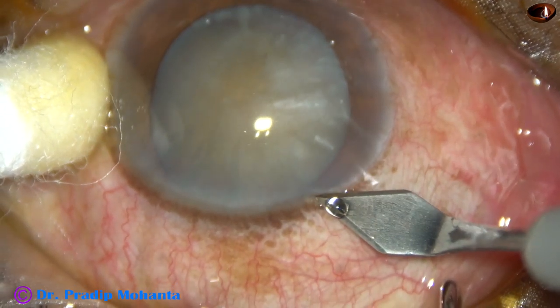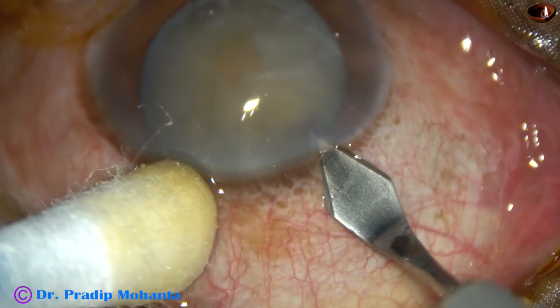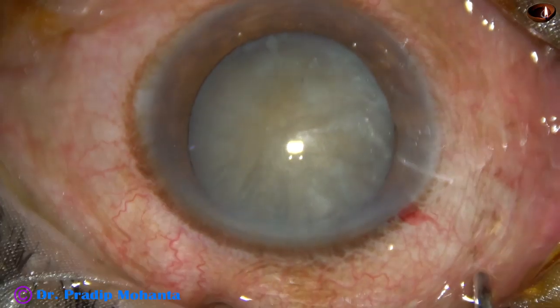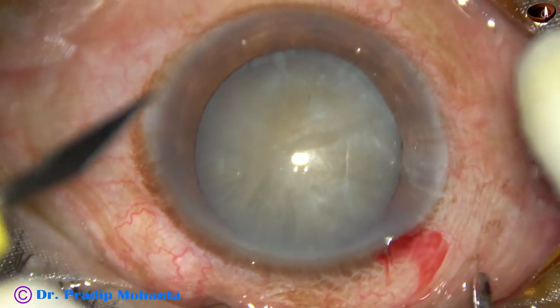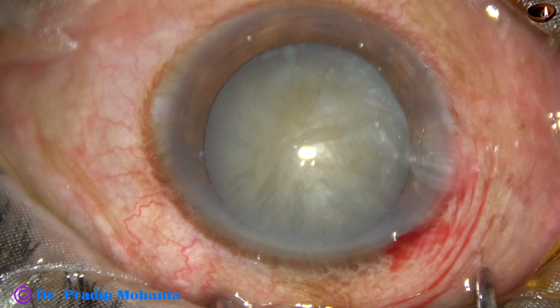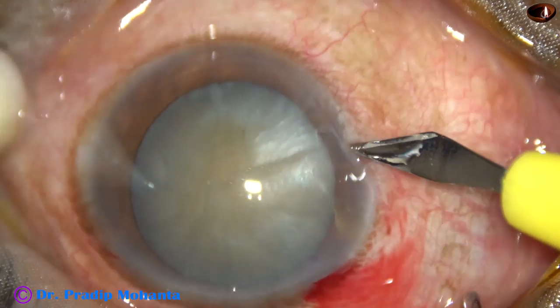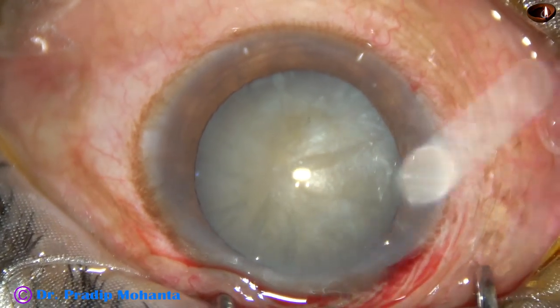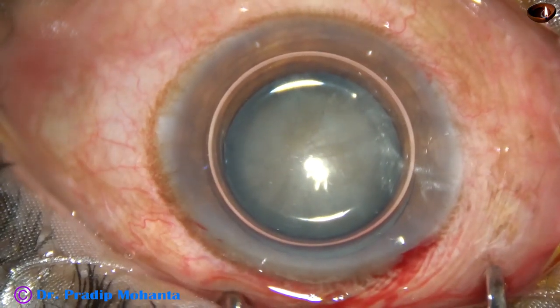This is the main incision on the posterior aspect of the limbus with a 2.8 mm keratome. Side ports are made — this is a side port on the left side, and this is another side port on the right side. The side ports are about 2.5 to 3 clock hours away from the main incision.